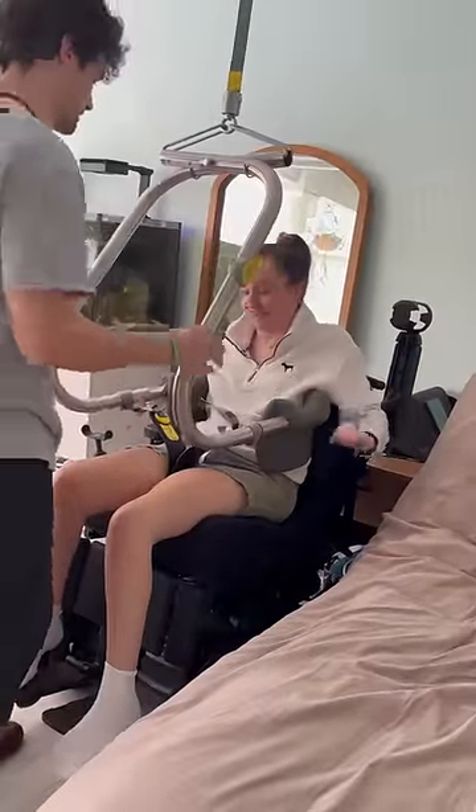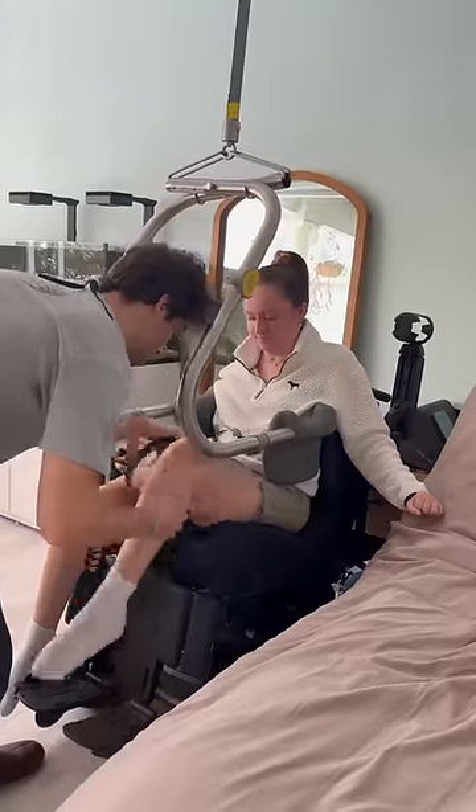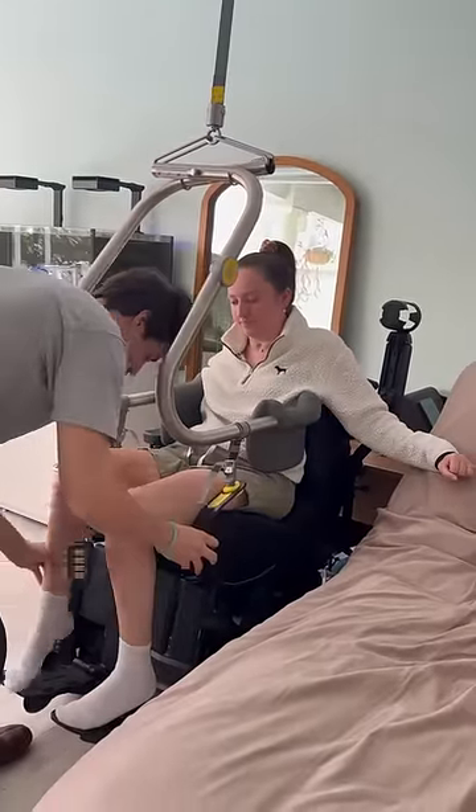Once I'm lowered all the way into the chair, I kind of push myself out and Jack takes the hooks off. It's really as easy as that.